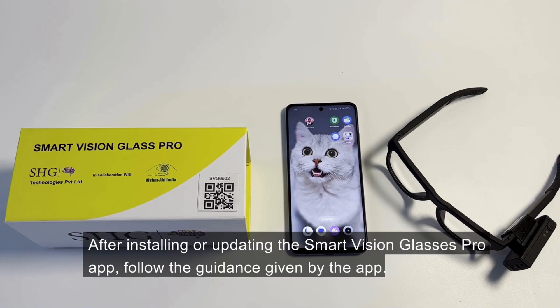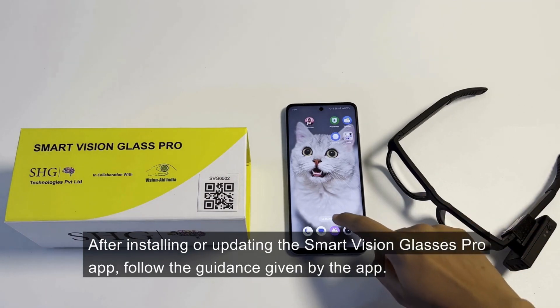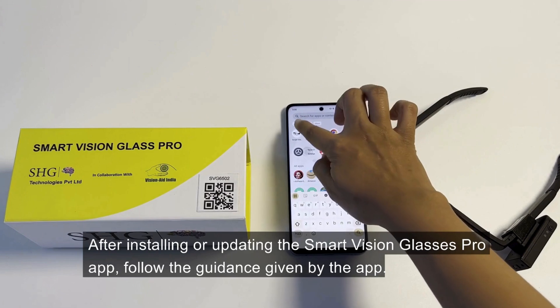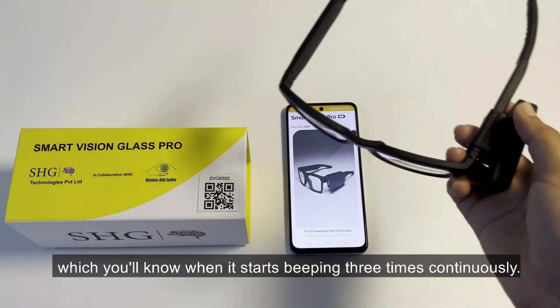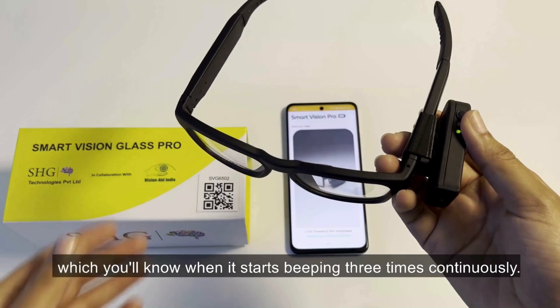After installing or updating the Smart Vision Glasses Pro app, follow the guidance given by the app. First, turn on your Smart Vision Glasses Pro device and wait for 40 seconds. The device will enter pairing mode, which you'll know when it starts beeping 3 times continuously.